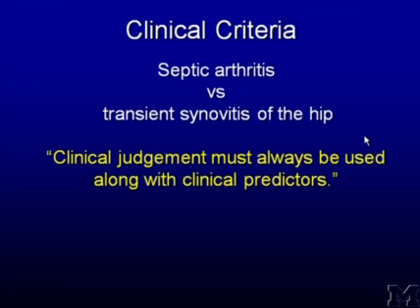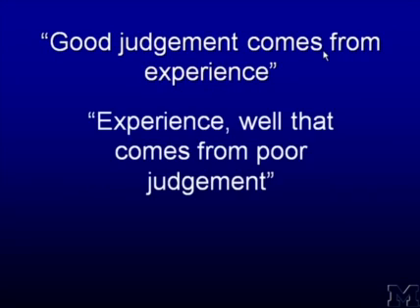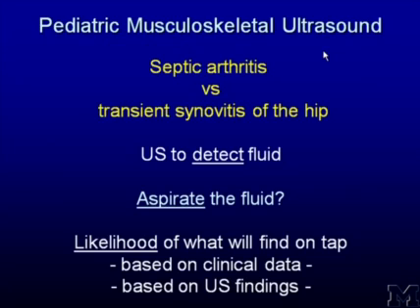So clinicians have to use some clinical judgment in trying to figure this out. And once again, this adage comes back to remind us all that the world isn't perfect. So sometimes you still have to analyze the fluid. And once we've detected it, sonography can be useful to help localize it and then to help obtain fluid.